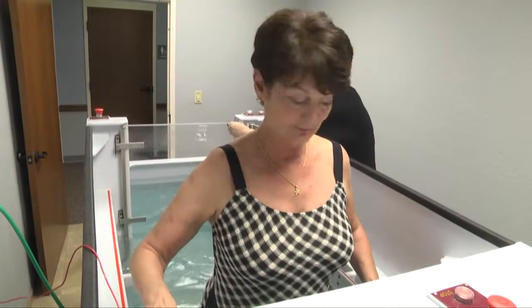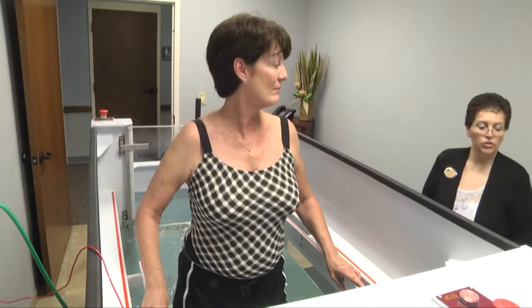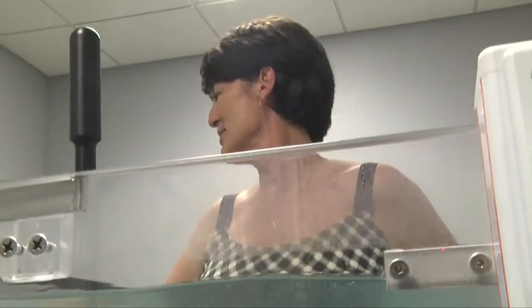Put the switch back in the upright position and hit the foyer pump button so that you pump the water from the foyer back into the main tank. Once that happens, then you can start your treatment with a treadmill or whatever you have going on.